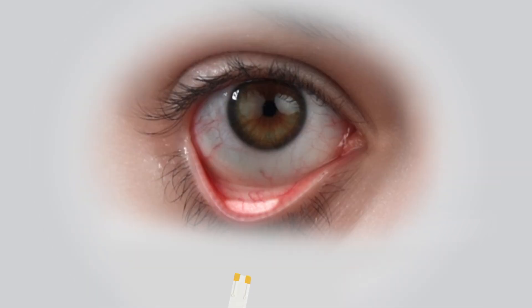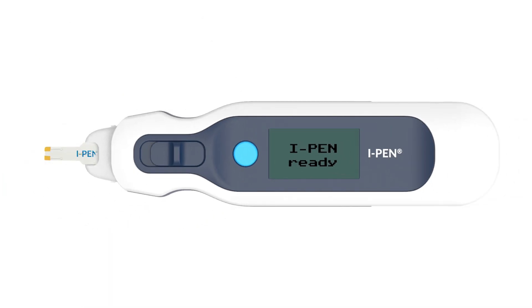When correctly placed, the tip of the single-use sensor should be depressing the surface slightly so both gold terminals on the tip of the sensor are in good contact with the conjunctiva. The eye pen will emit an audible beep after taking 192 readings in several seconds and will display the results on the LCD screen.